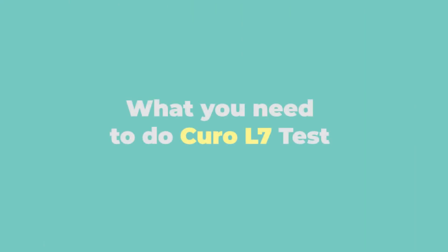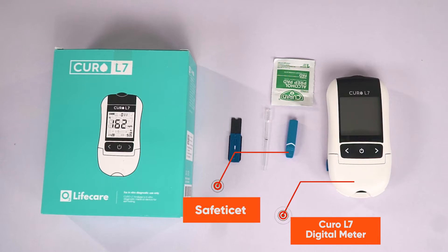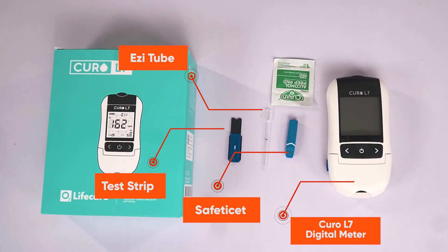I have here everything that I need to start the test: the Curo L7 digital meter, safety lancet, easy tube, and profile test strip.